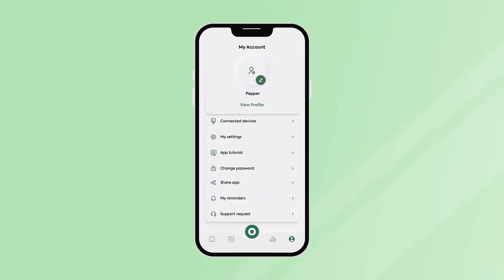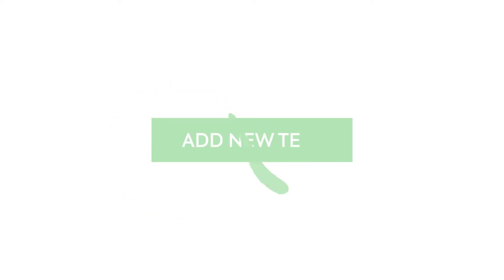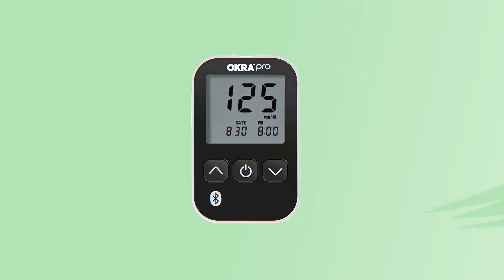Now, let's go ahead and start logging. Add new test. Before we connect the device, we need to perform the blood test first.